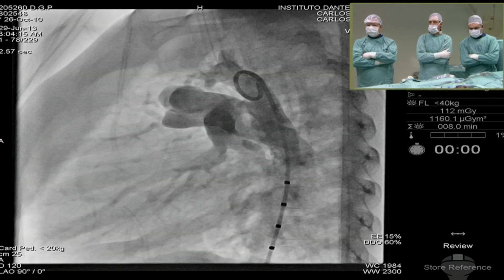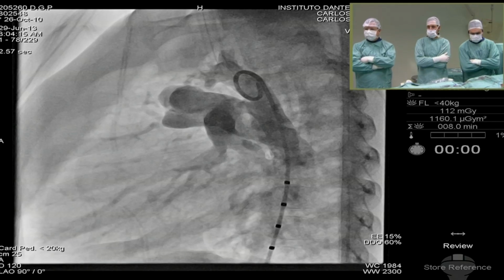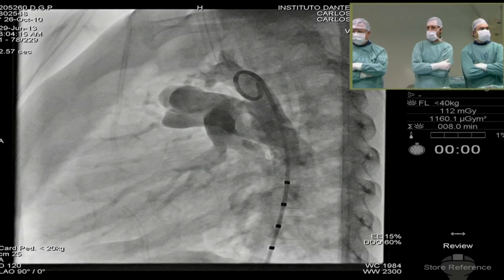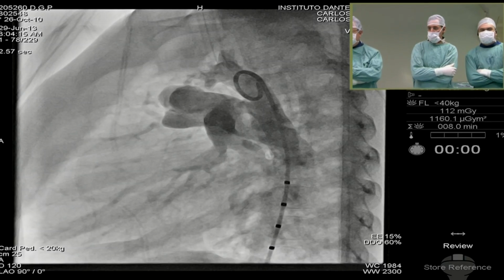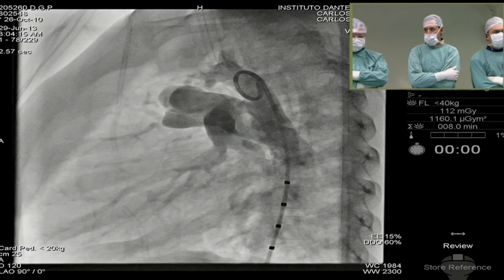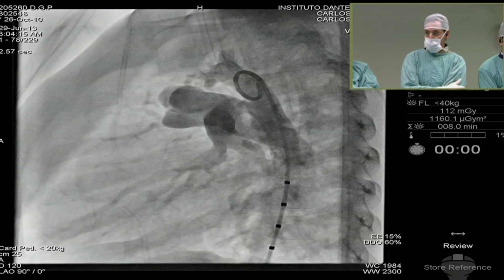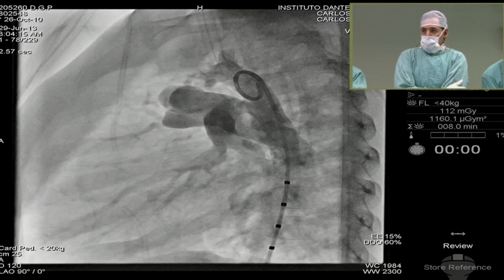Okay. So, Zahid, anatomy and what device? The device he's choosing is a duct occluder device. Yeah. What would you use in this scenario? He can use whatever the Occlutech or PDA device. Okay. Implants. Alejandro, is that? Yeah.